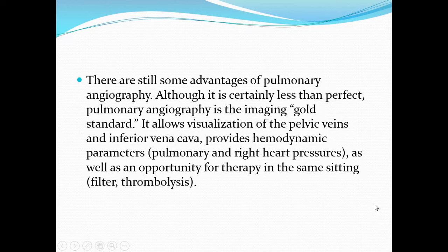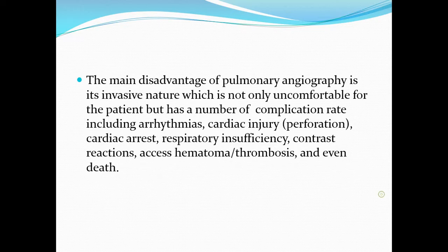There are still some advantages of pulmonary angiography, although it's certainly less than perfect, but it's the gold standard. It allows visualization of the pelvic veins and the inferior vena cava, provides hemodynamic parameters like the right-sided heart pressure and the pulmonary artery pressure, as well as opportunity for therapy in the same setting, for example, filter or thrombolysis.